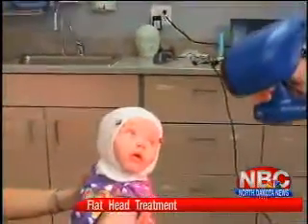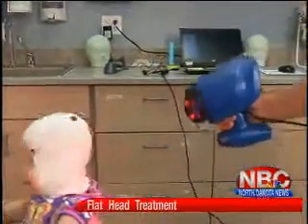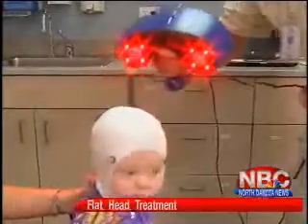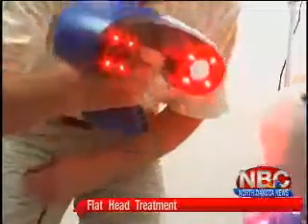Ivy's the one doing all the work. With this new scanner, as she moves her little head around, the device scans her skull within a millimeter of accuracy. She's been in it for a month and there's been significant improvement so far.